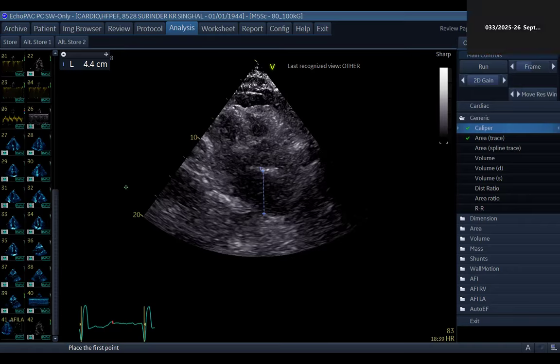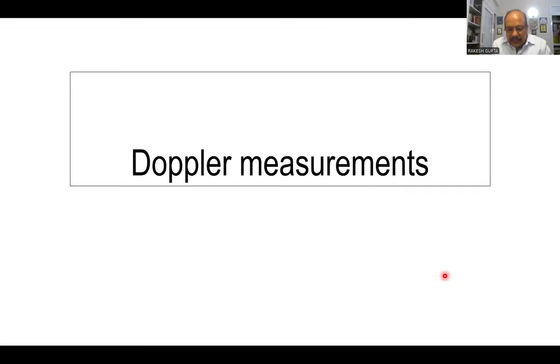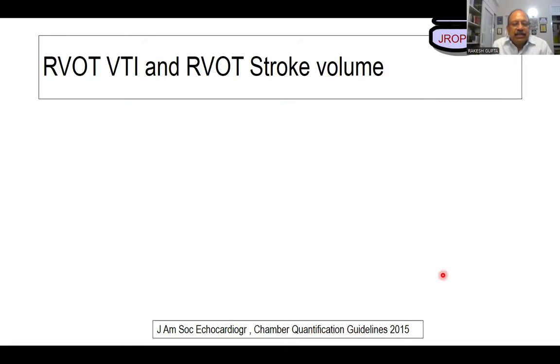In the last slides, you were talking about the apical four-chamber view and the modified RV view. How will we change that apical chamber view to get a modified RV view? Do we have to move the transducer to a certain angle? Honestly, I can't tell you how to do it, but I can only say that this comes with handy practice.